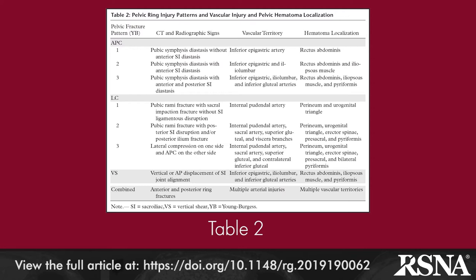The direct CT signs of arterial injury include abrupt narrowing of an artery, seen in intimal injury with thrombosis, vasospasm, or intramural hemorrhage; intraluminal linear filling defects, as seen with dissection; focal outpouching, as in a pseudoaneurysm; active contrast extravasation reflecting transmural injury and transection; arterial cutoff or non-visualization indicating thrombosis or transection; and early opacification of the veins in the arterial phase, indicative of arteriovenous fistula.